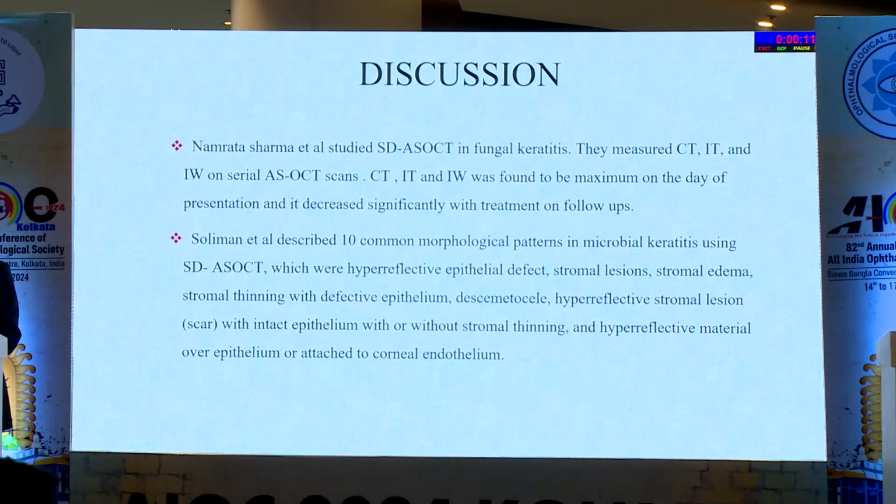Namrata et al. studied ASOCT in fungal keratitis. They measured the corneal thickness, corneal infiltrate thickness and infiltrate width on serial ASOCT scans. Corneal thickness and infiltrate width were found to be maximum on the day of presentation and decreased significantly with treatment on follow-up.